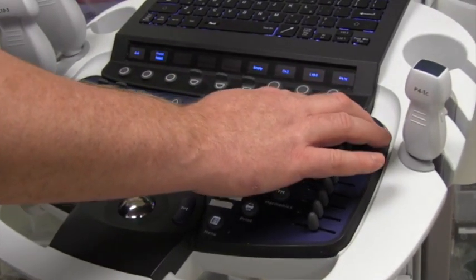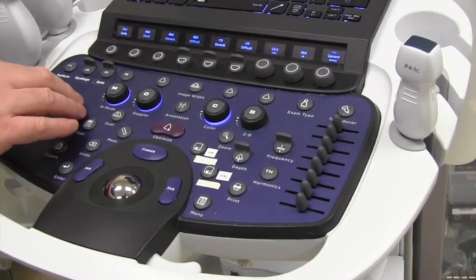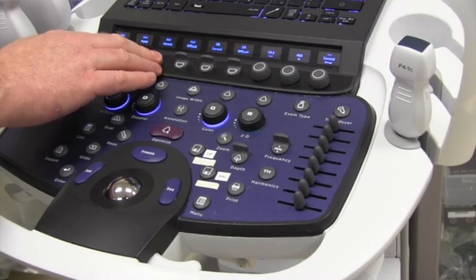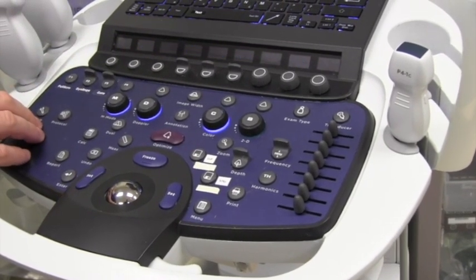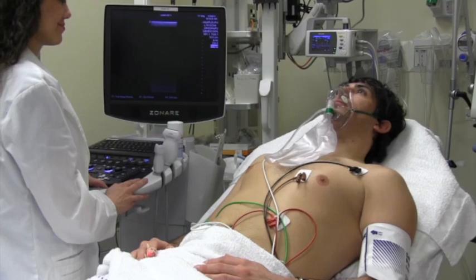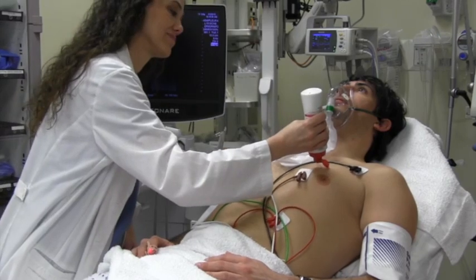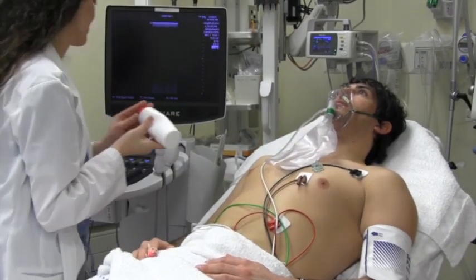If your machine has a lung ultrasound preset, select it. However, if your machine does not have a lung ultrasound preset, choose the abdominal setting. You must turn off any advanced image processing such as compounding or harmonics. Now apply a thick gel cushion to the anterior upper quadrant of the right chest.